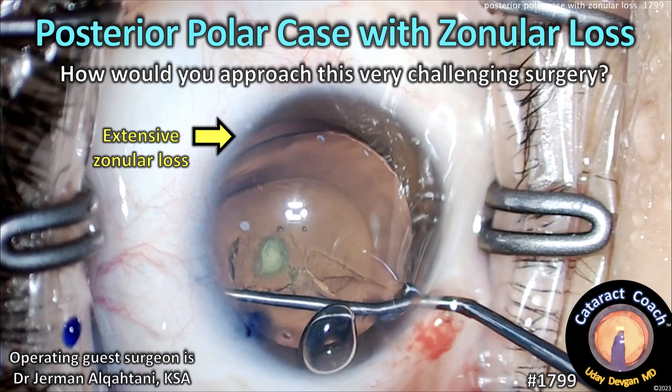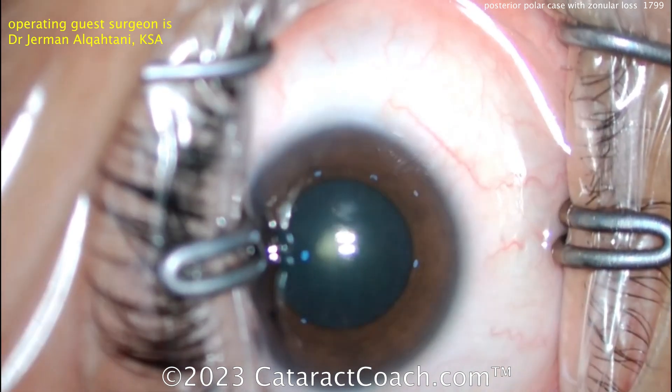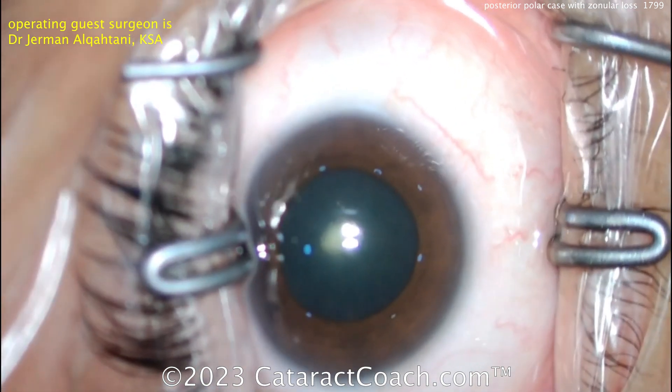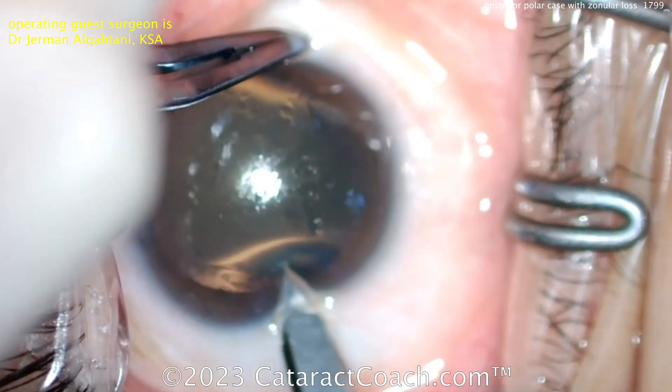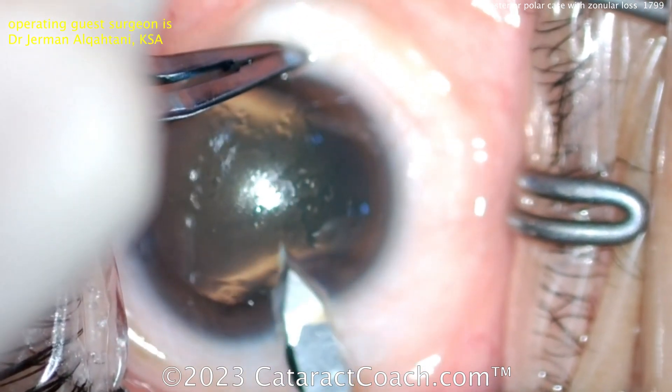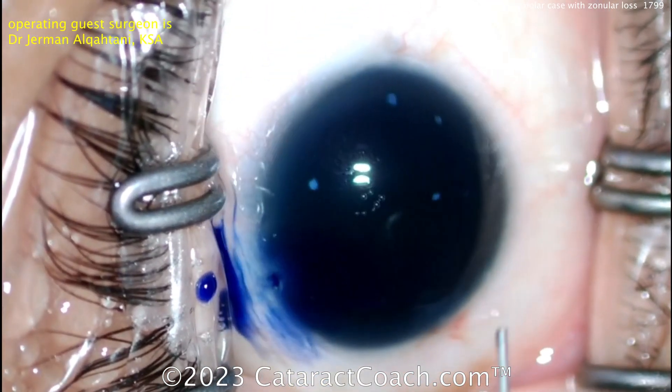Cataractcoach.com posterior polar case with zonular loss — how would you approach this very challenging surgery? Let's watch. There's the posterior polar cataract; you can definitely see it has that very characteristic look. Now starting the case — the main incision is being made and our guest surgeon is a very experienced surgeon.